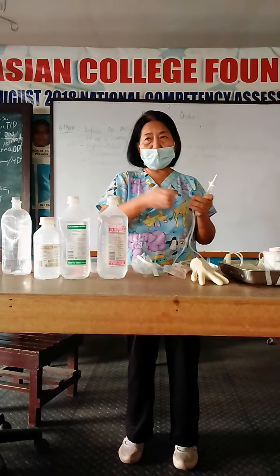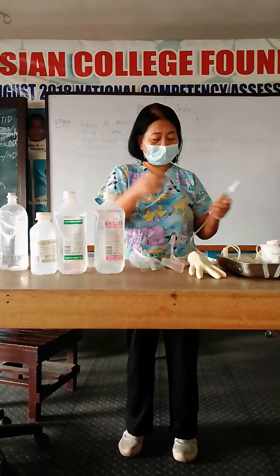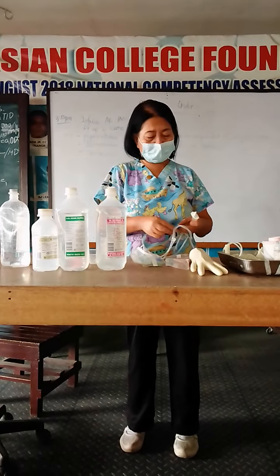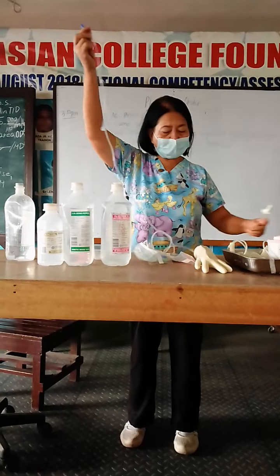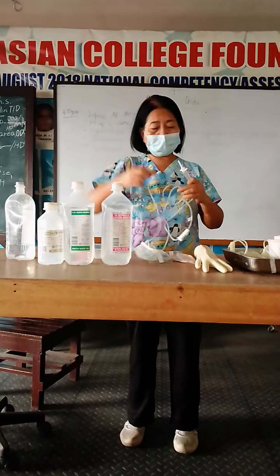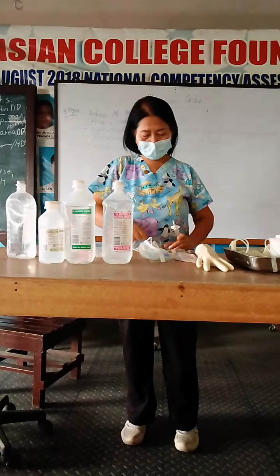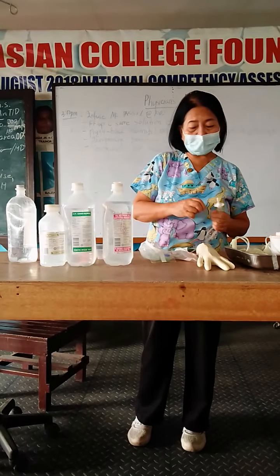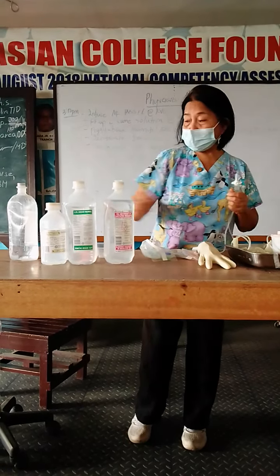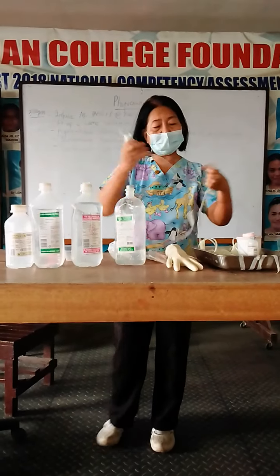Of course, for additional score, you always mention the cap or the cover. And to complete the score, you have to identify the tube itself. Okay, so I'm sure already of the doctor's order. It corresponds with the solution that I prepared.